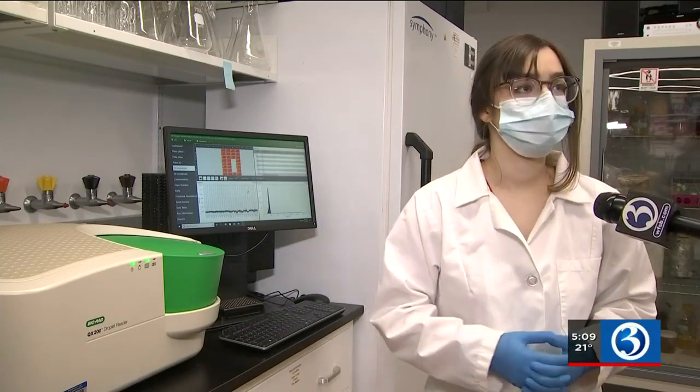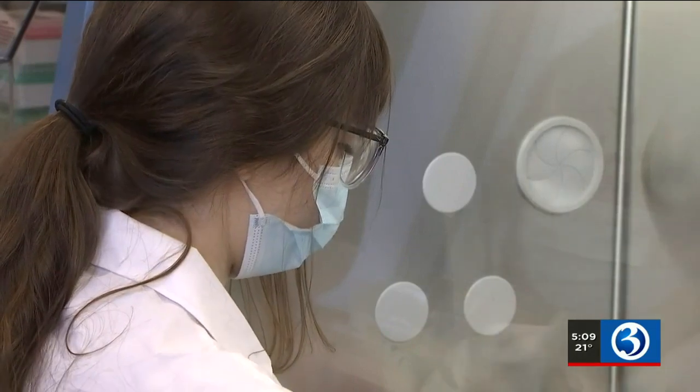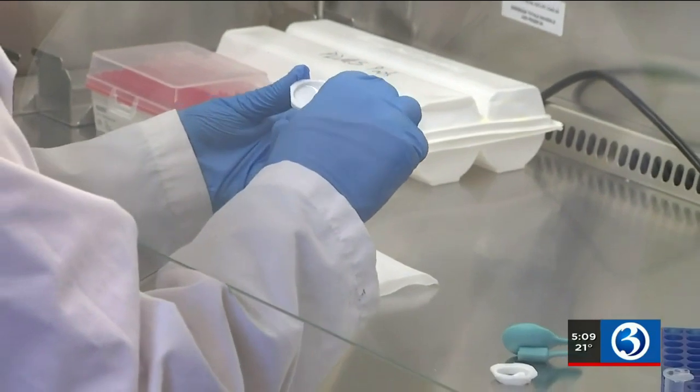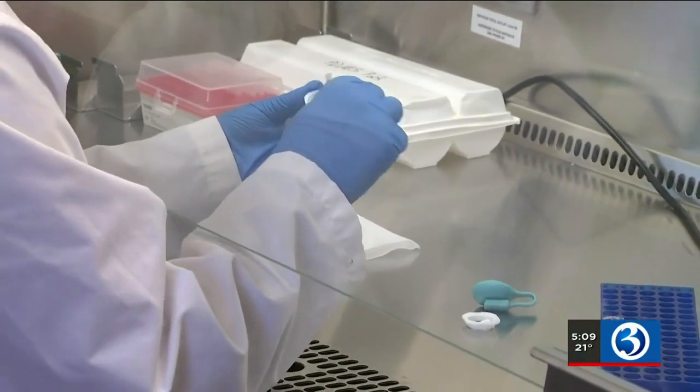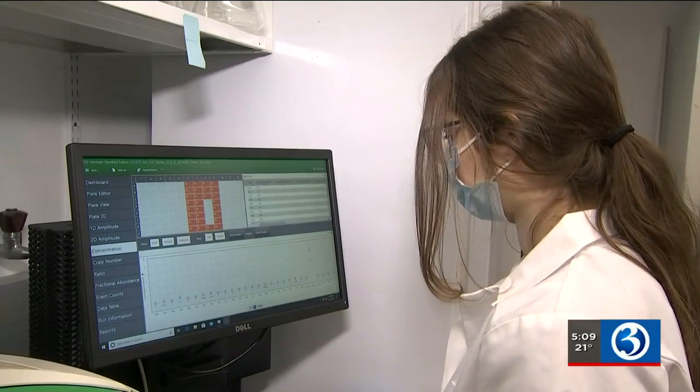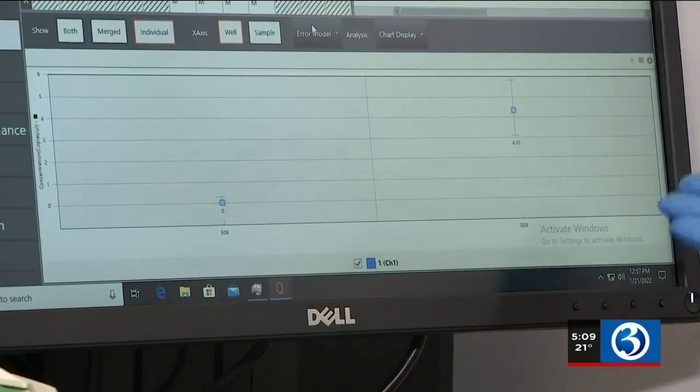That will then tell us if there was any COVID detected in the sample and at what concentrations. Researchers put it to the test last year between January and May. 62 Connecticut residents wore the clip to their jobs at hospitals, homeless shelters, and restaurants. Others wore it to the gym and the grocery store. 5 of the 62 devices came back with a positive COVID sample. 4 of those were among restaurant workers, and 1 was within the homeless shelter staff.